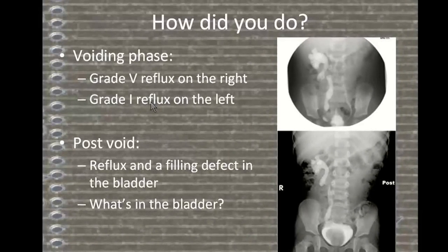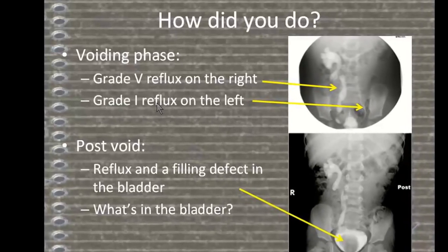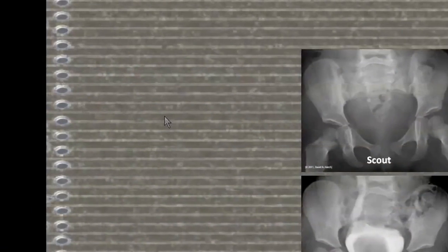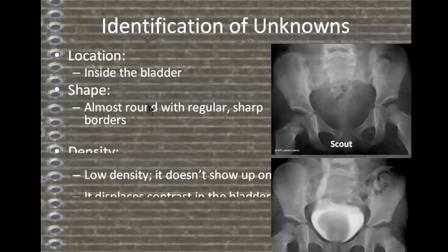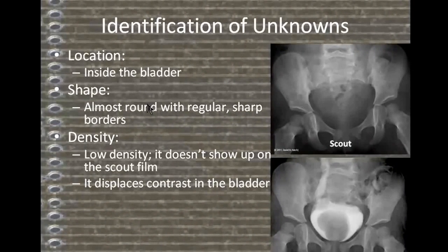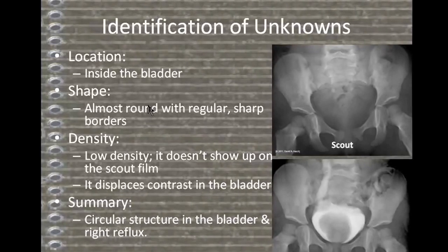Post void: reflux and a filling defect in the bladder. What's in the bladder? Identification of unknowns — location: inside the bladder; shape: almost round with regular, sharp borders; density: low density, it doesn't show up on the scout film. It displaces contrast in the bladder. Summary: circular structure in the bladder with right-sided reflux.